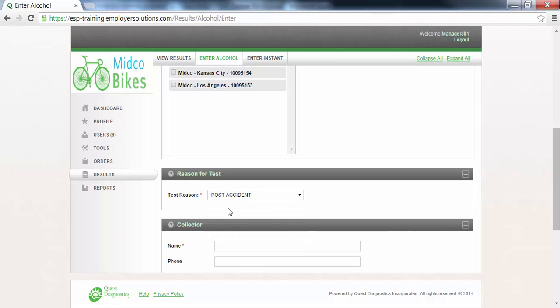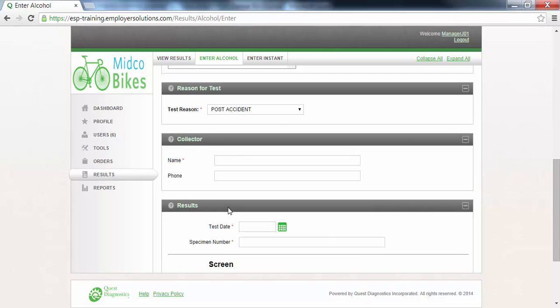The collector section is where you will enter the name and phone number of the person who performed the breath alcohol test. The name field is required as indicated by the red asterisk. In this example we will enter Susan Jones.